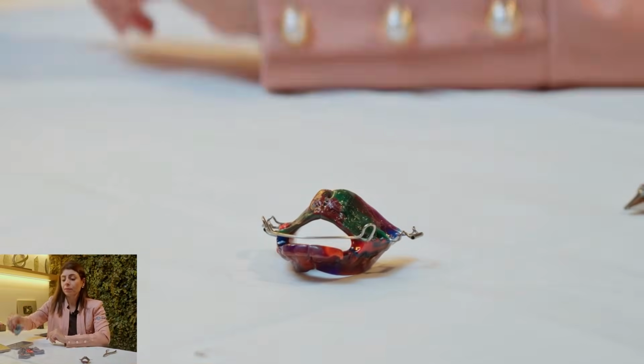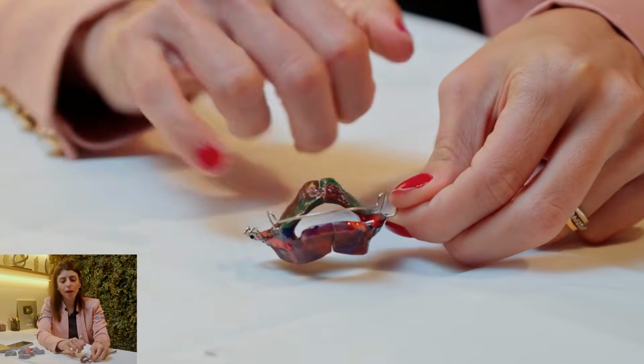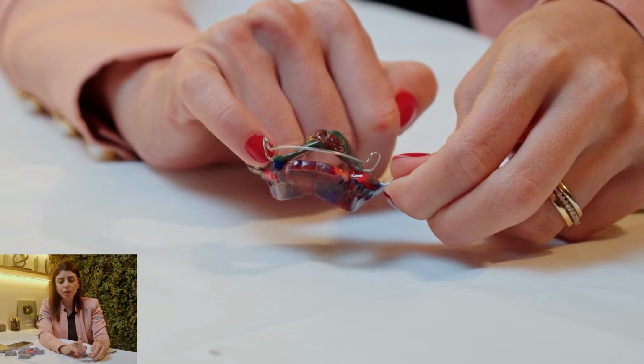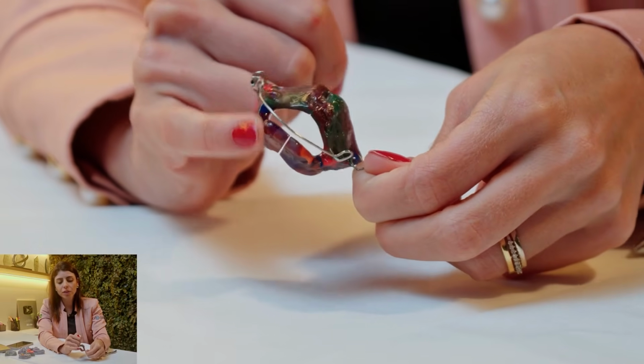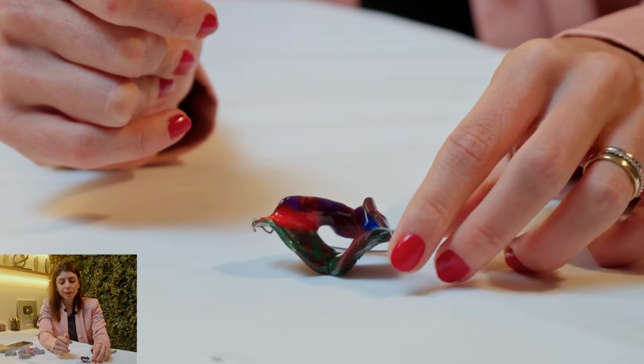This is an activator. It's a mandibular propulsion appliance, the Andresen activator type. The Andresen activator is made of a single structure, where I have a vestibular arch, an Adams clasp for retention, and I generally like to also place a little retention hook here. I have this anterior part, which is the anterior shield where the lower incisors fit, and something very good, which is the expansion screw, which can also perform a dental expansion of this upper arch.